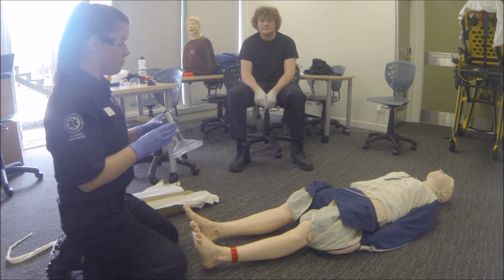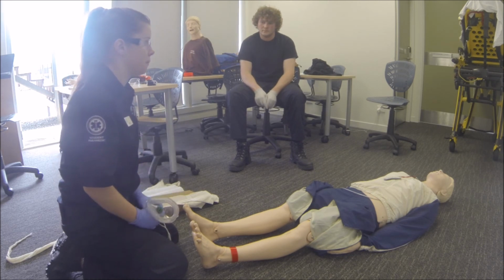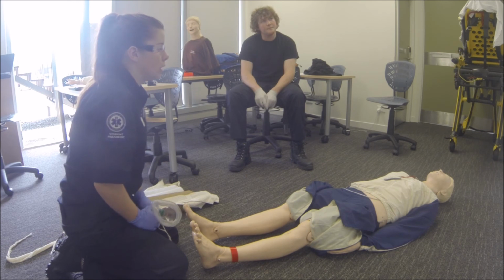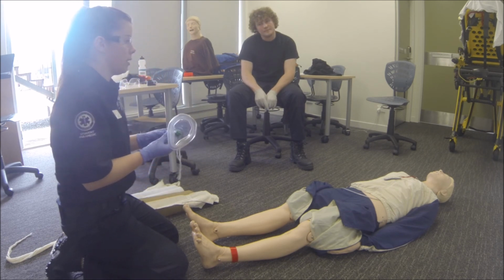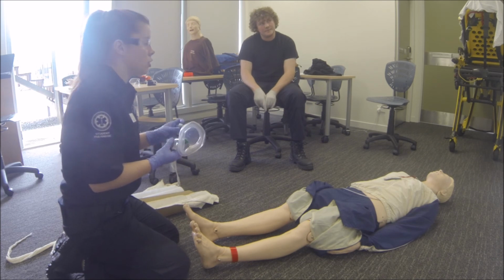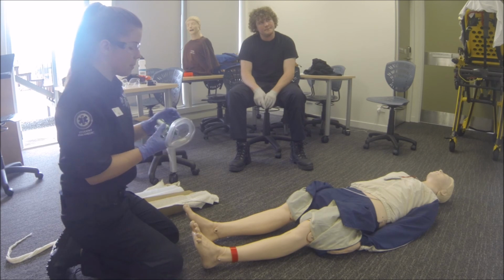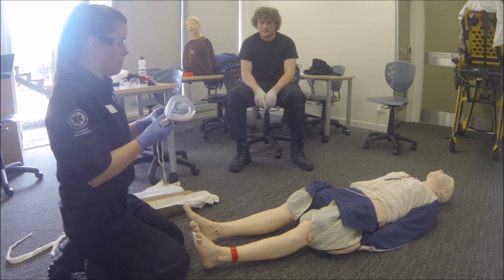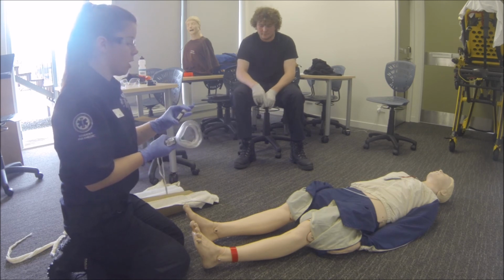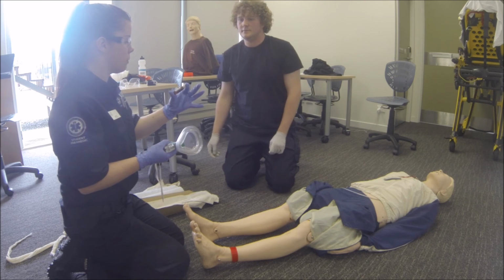patient. So sir, do you have any history of malignant hyperthermia in your family? No. Do you have any known renal impairment? No. Have you had methoxyflurane in the past week? No. Do you have any known allergies to any medication? No. And because he can answer my questions, he's obeying commands. So first, before I administer it, I'm just going to do a drug check on the methoxyflurane, which is methoxyflurane 3 mils, expiring 2017.